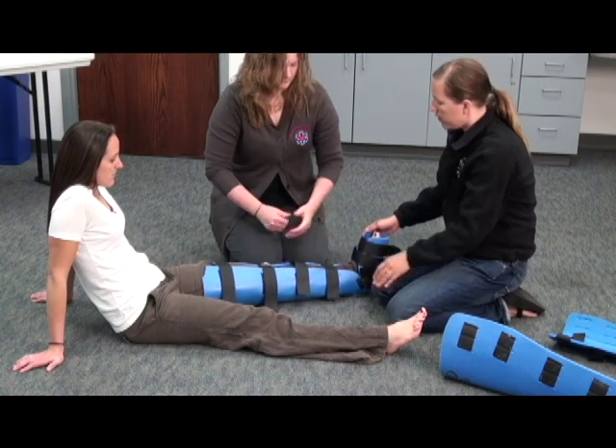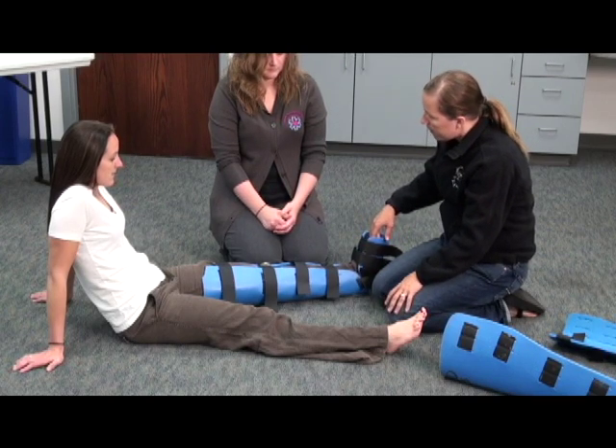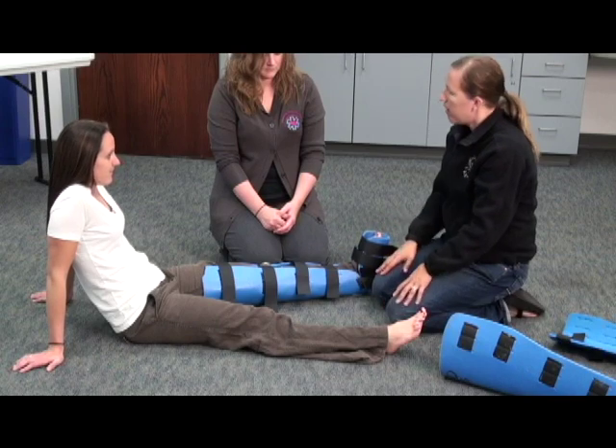At this point, you can let go, and I'm going to once again check CMS. Does she have a good pulse? Ma'am, can you feel me touching you? Yes. And can you wiggle your toes? I'm done with the station.